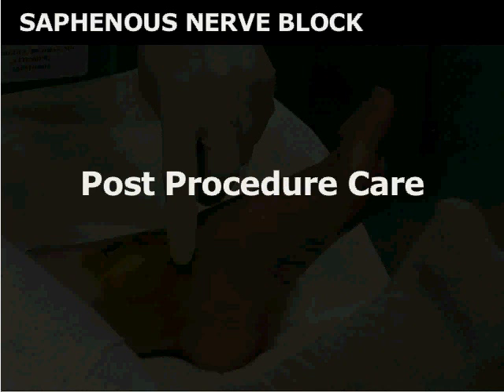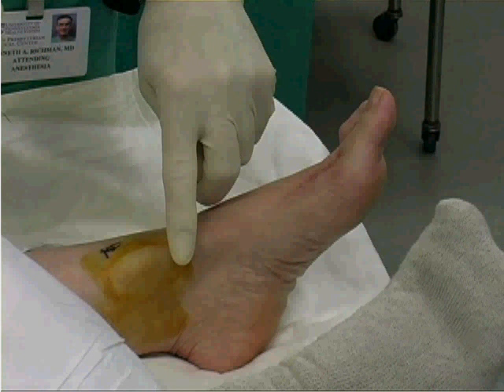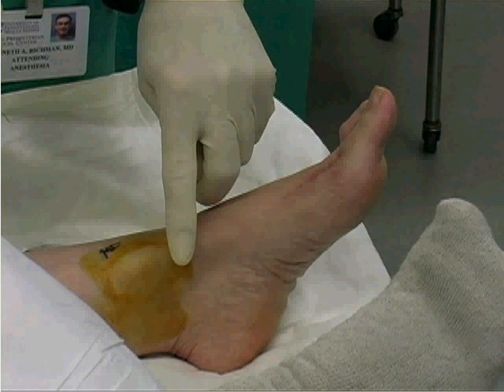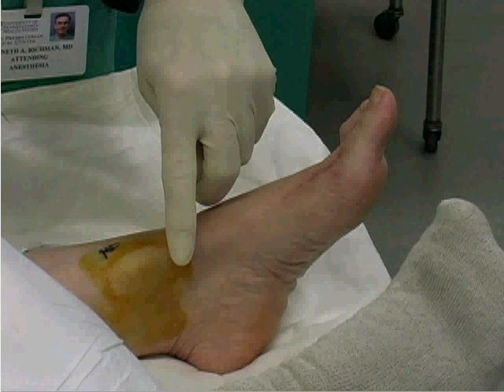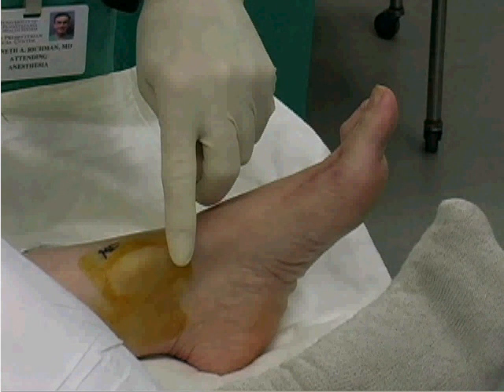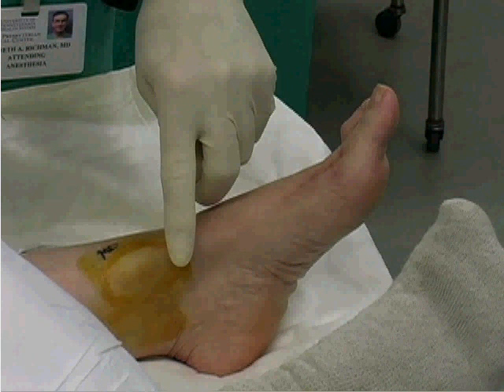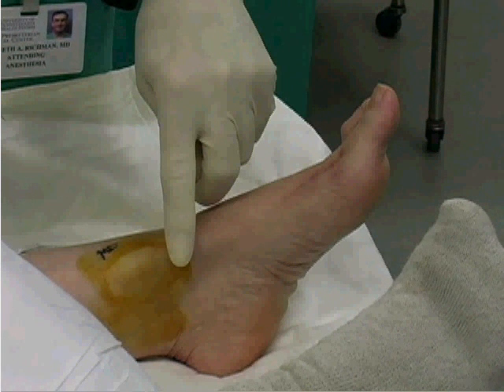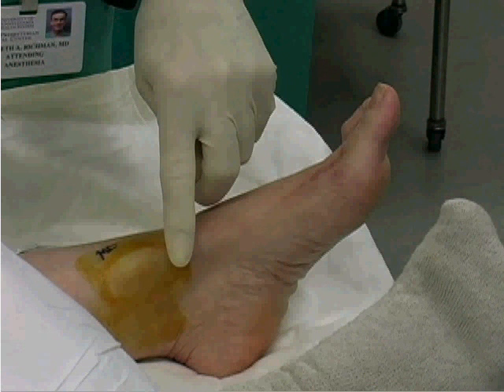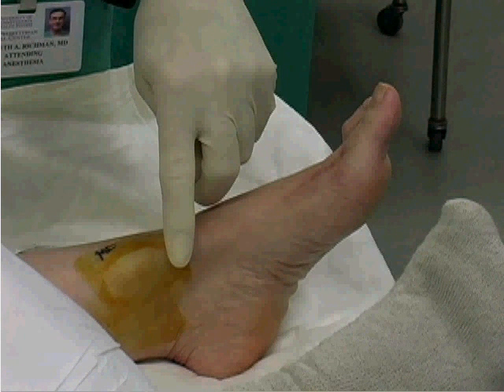The saphenous block is a minimally invasive procedure requiring little post-procedure care. Upon completion of the block, the leg and foot can be positioned for surgery. As with any regional block, allow adequate time to achieve the complete effect of anesthesia prior to surgical incision.